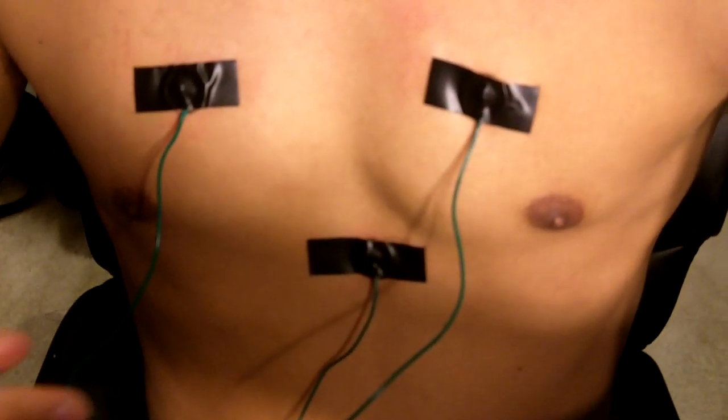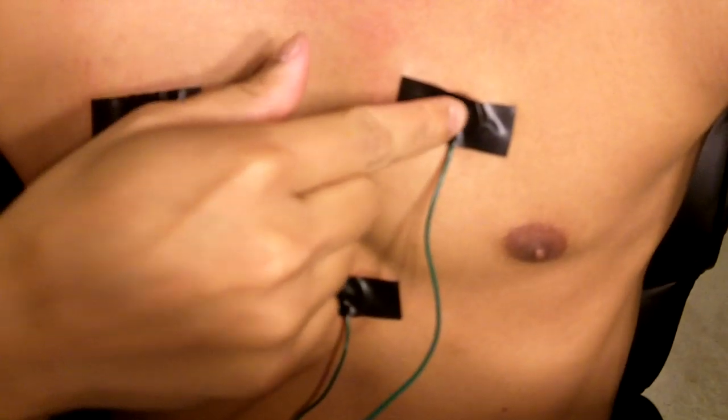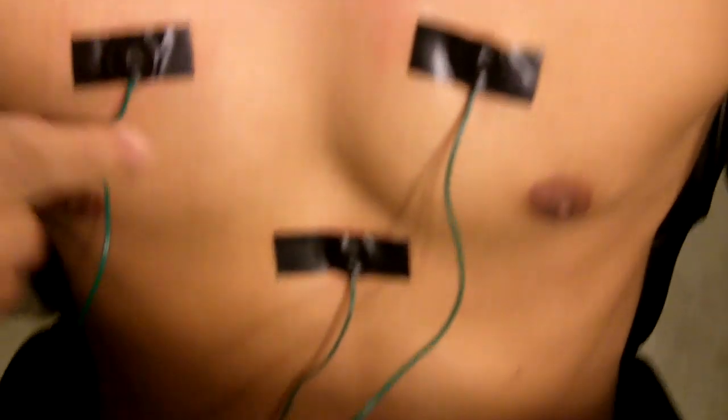Here you can see some electrodes - one, two, and three - which is then connected to an instrumentation amplifier. Here is where the left and right electrodes go, and the other electrode is the ground electrode.